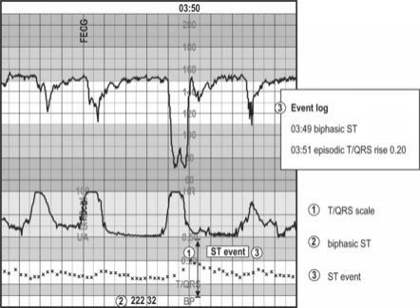So why pursue any of this? Well, thankfully, the authors address this, so let me quote them. Quote, "It has been assumed that similar levels of non-intervention can be achieved by means of better in-service training and fetal heart rate monitoring. In practice, such improvements are difficult to achieve and indeed have not been achieved despite 30 years of electronic fetal heart rate monitoring in labor."